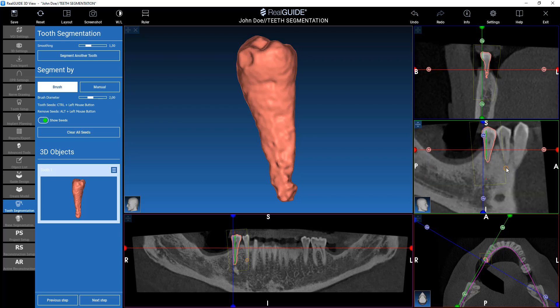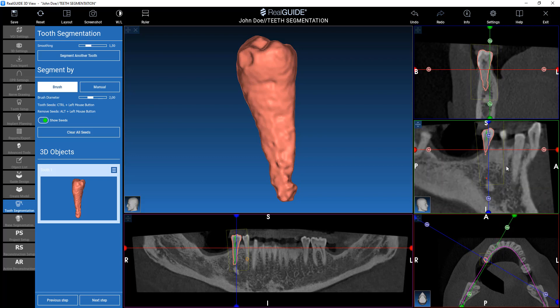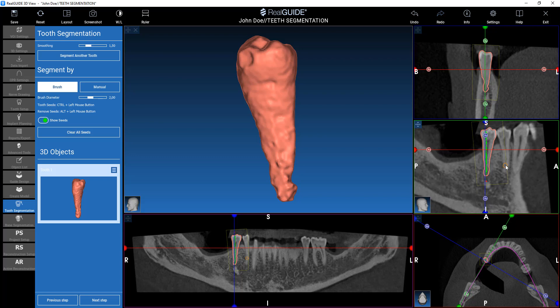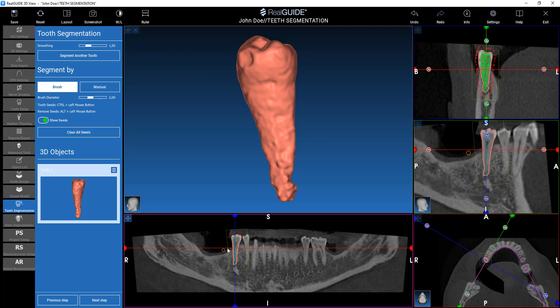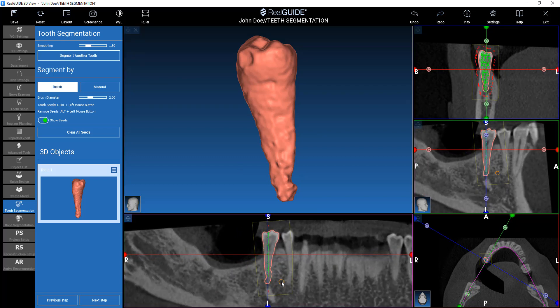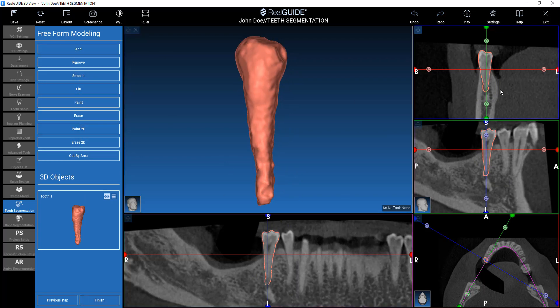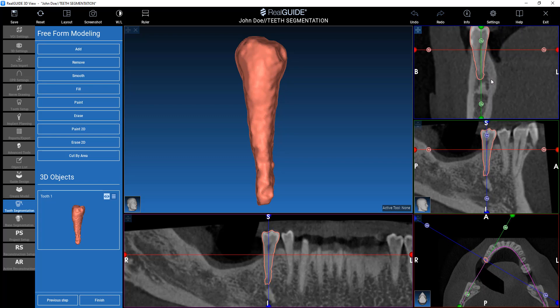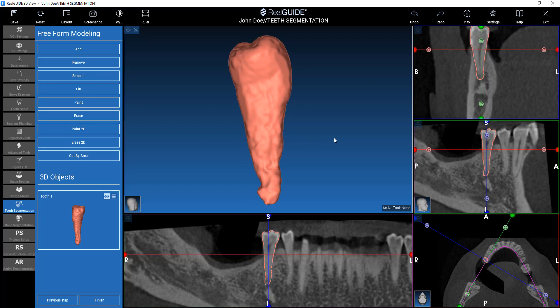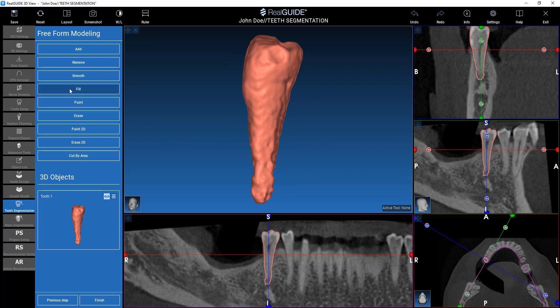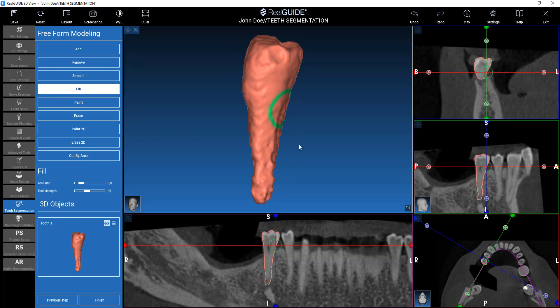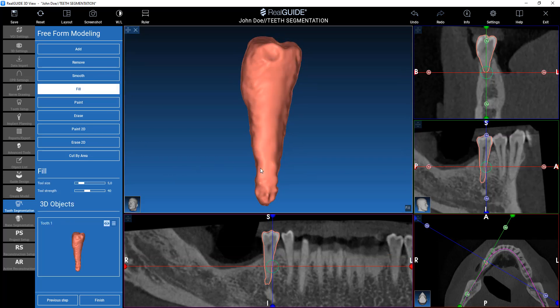What I can do is check if the segmentation is correct and eventually move to another tooth, or I can click on Next Step and use the freeform modeling tools to fine-tune my segmentation. In this way, we are now working basically on an STL file.